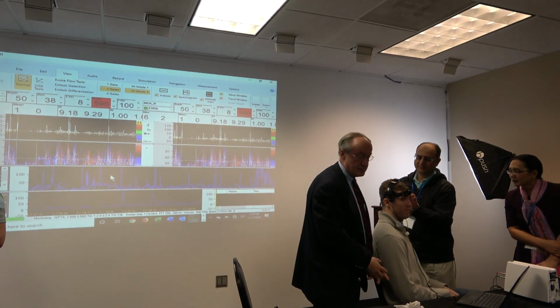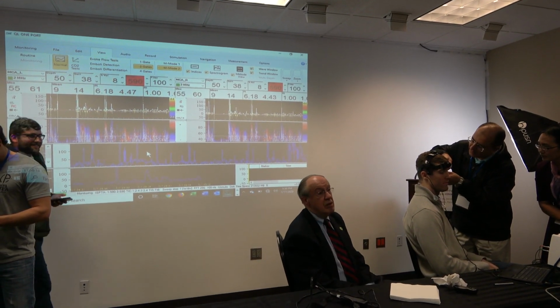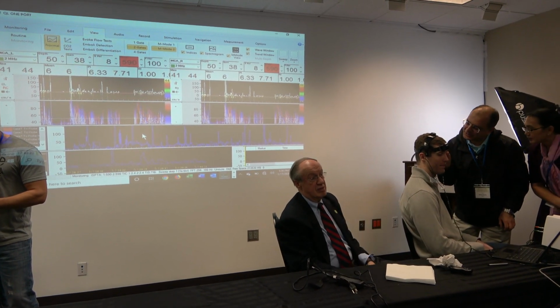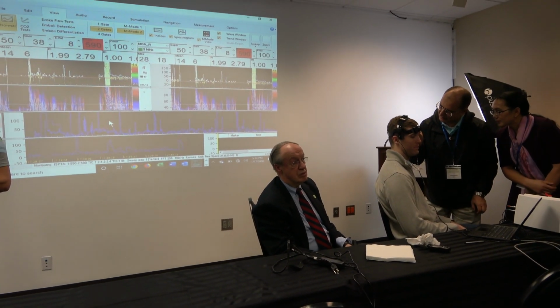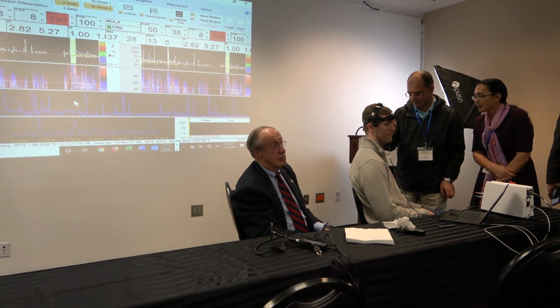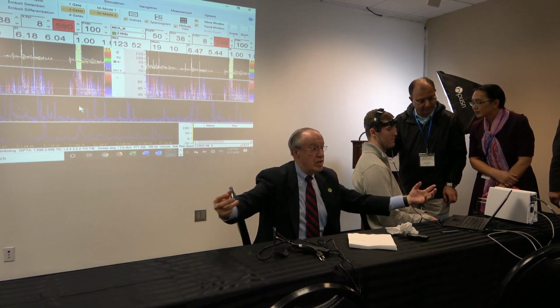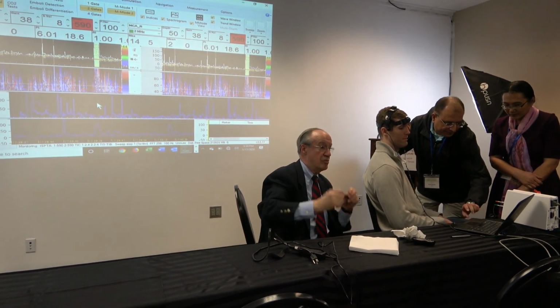One of the slides that you showed looked like the screen from Cadwell Cascade. Yeah. And it had the TCD on it. It was one display and different machines are feeding this display. Okay, so it's compatible with some TCD hardware. The TCD machine has video out, so you can use the video in the Cadwell machine. Oh, so that was actually two screens just next to each other? No, it was one Cadwell display, and on this display several feeds from TCD, from infrared, and from others.